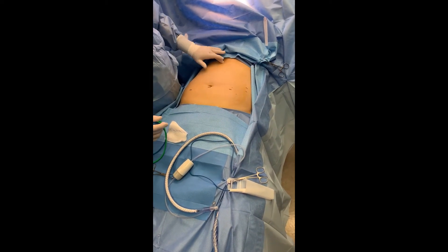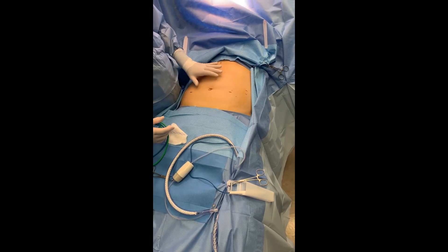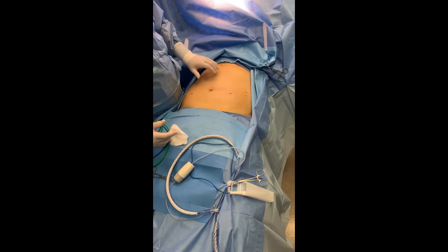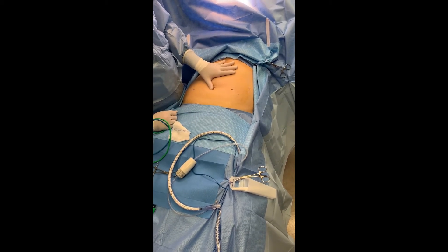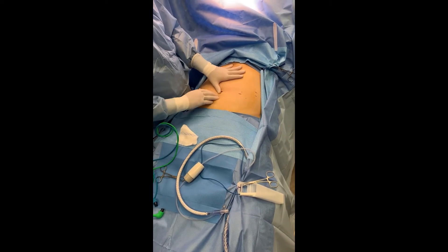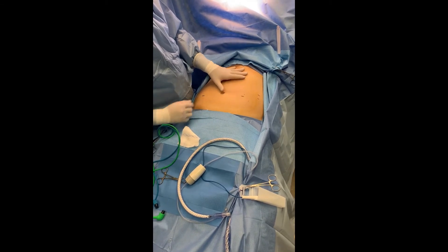I generally identify where the xiphoid process is. My Nathanson retractor is going to go right below that. I know that the span from my little finger to my thumb is about 22 centimeters.